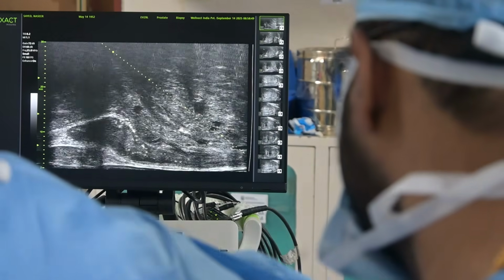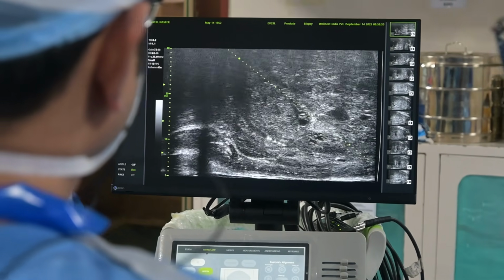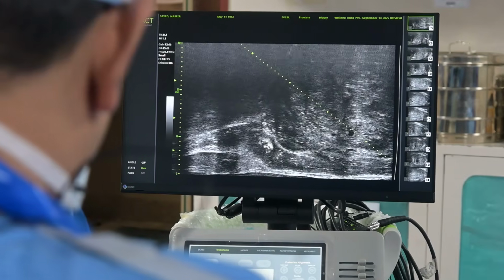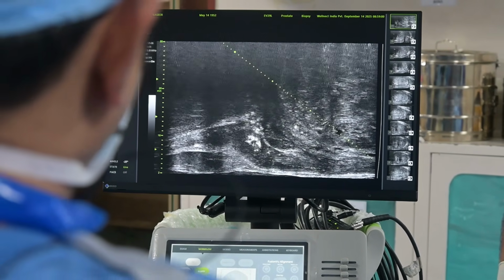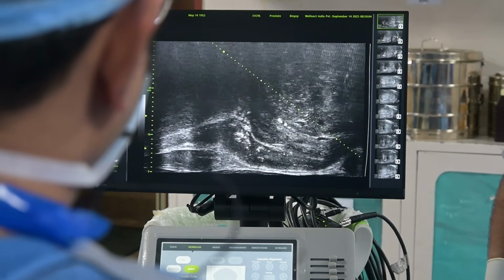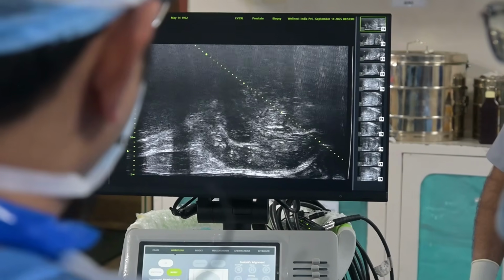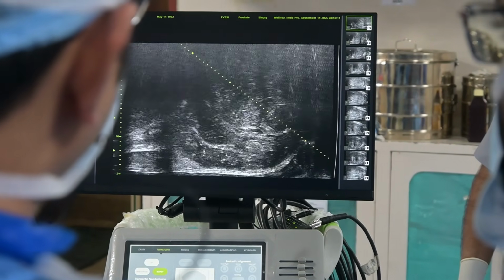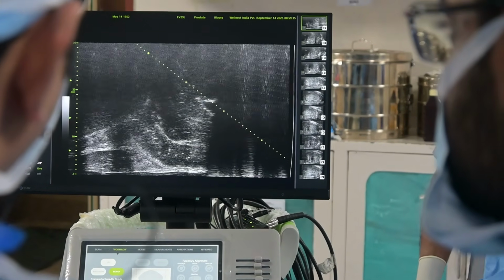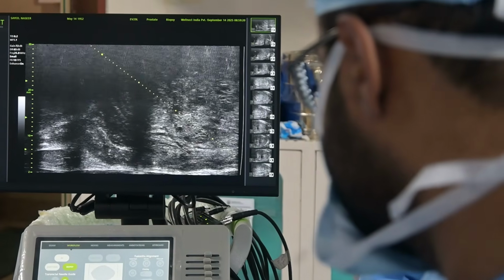Yes. Abhishek sir, your mic on, sir. Okay, so you see a targeted nodule at the mid side of my screen. This is the nodule that you see. This is mostly a benign nodule. So I have done the right side. I am waiting for you to show the left side. And now please be with me for 2 minutes so that I can show you all the targets. So this is the benign nodule. This is the nodule that I am targeting, and my needle went through that nodule. I'll take 2 from this target.